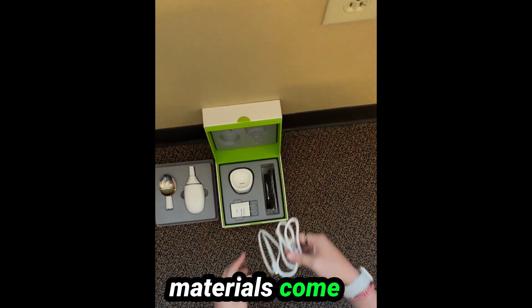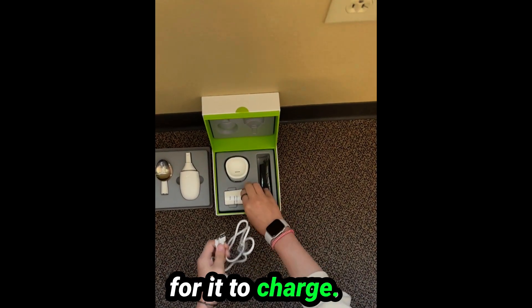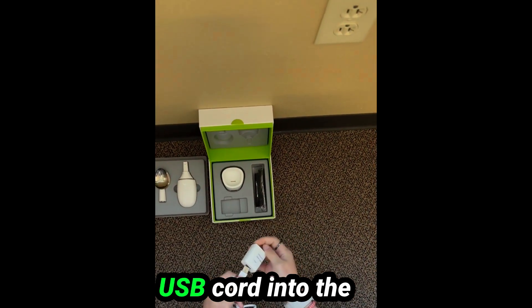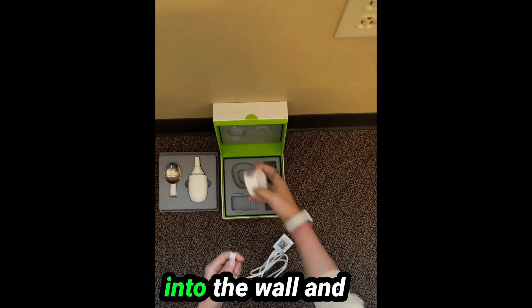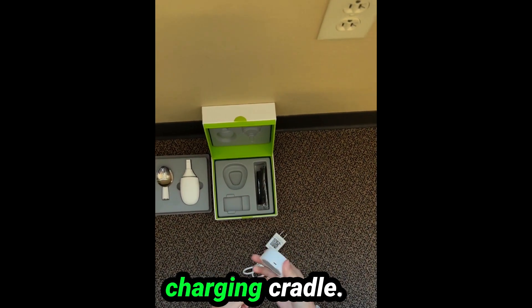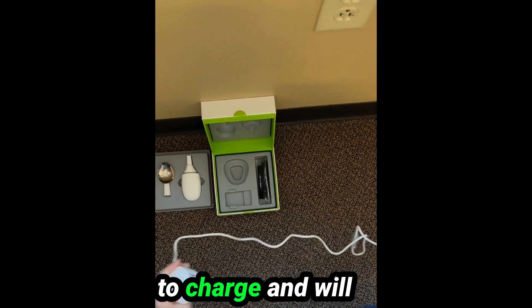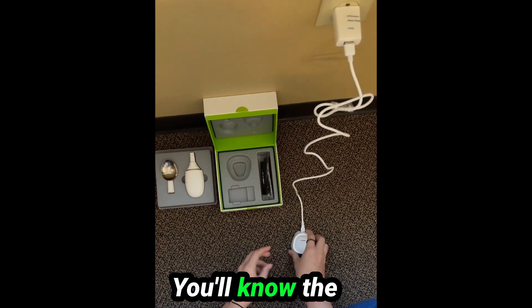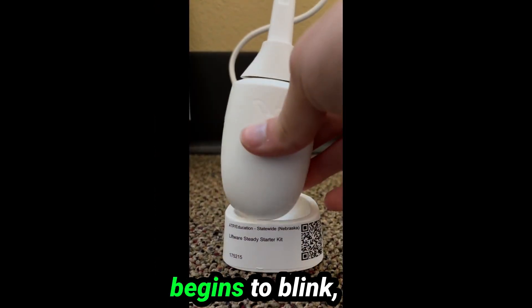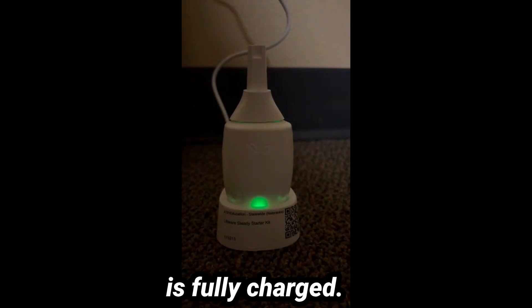The charging materials come in the starter kit. The attachment has to be taken off the handle for it to charge. You can plug the USB cord into the wall adapter and the charging cradle. The wall adapter can then be plugged into the wall and the handle should be placed into the charging cradle. The handle takes about three hours to charge and will stay charged for about one hour or three to six meals. You will know the handle is charging when a green light begins to blink, and then that green light will change to solid when it is fully charged.